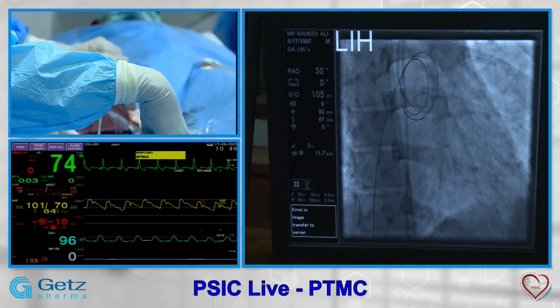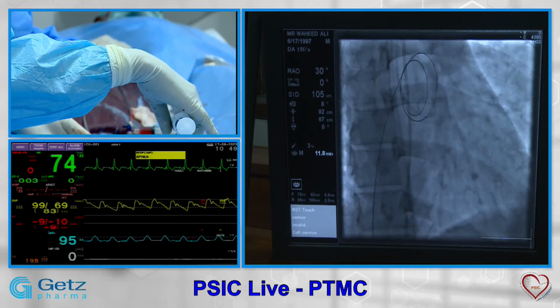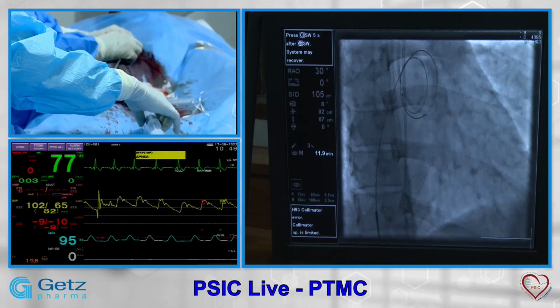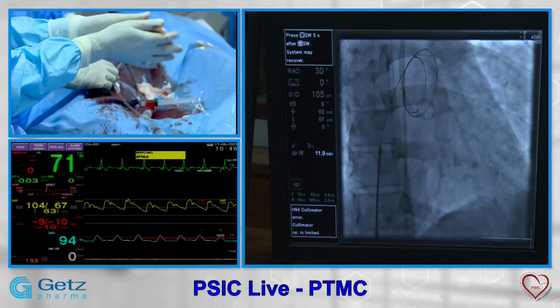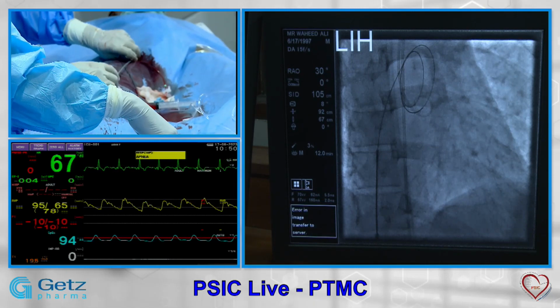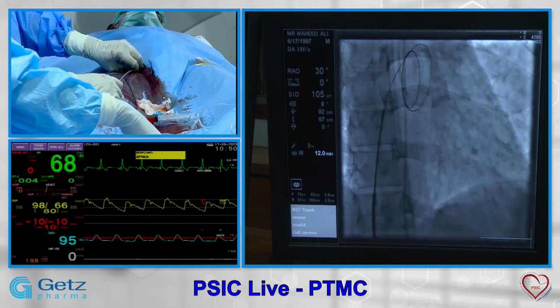Our practice at NICVD is that we don't stretch this valve directly. We usually dilate it. If the size is 26, we dilate it with a 24 size, keep it a little less, and then make it 26 in the second dilatation. So now we have got this size of 24.